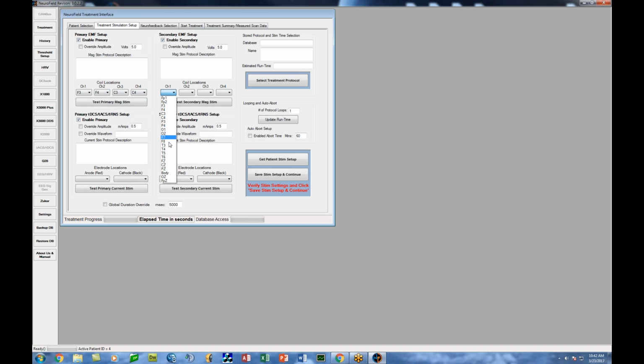And let's see, we'll go T3, T4, and O1, P3, P4. This is a little bit of a different configuration. And then we're going to set up our units to do FP1 to O1, FP2 to O2. And there we go. Now I'm going to set a treatment protocol.